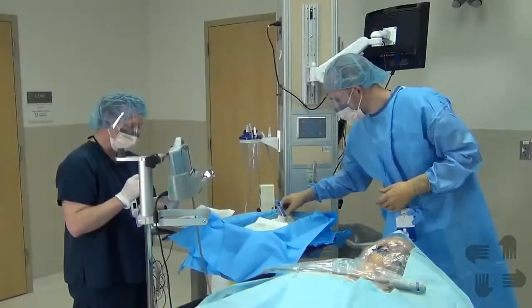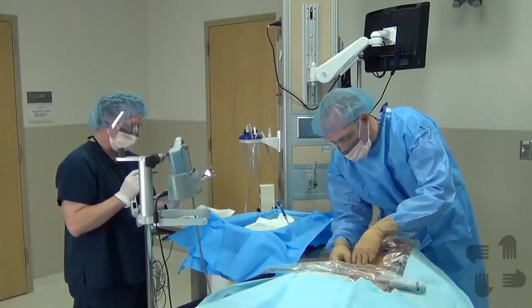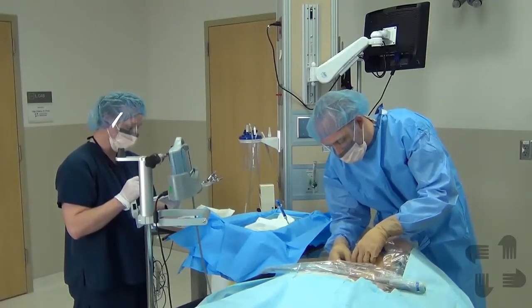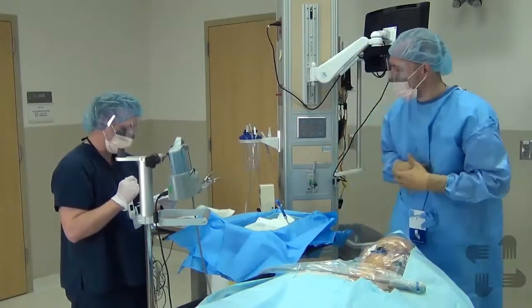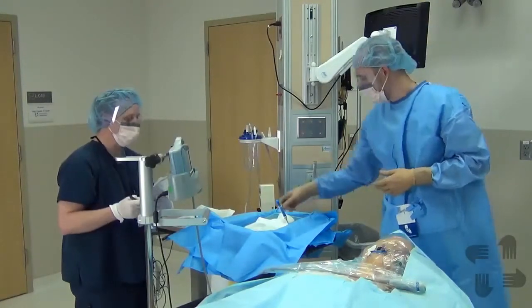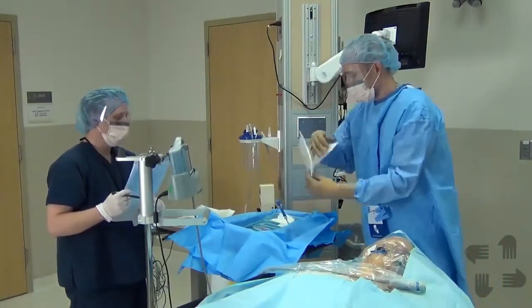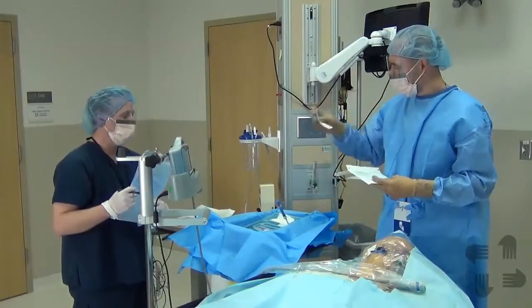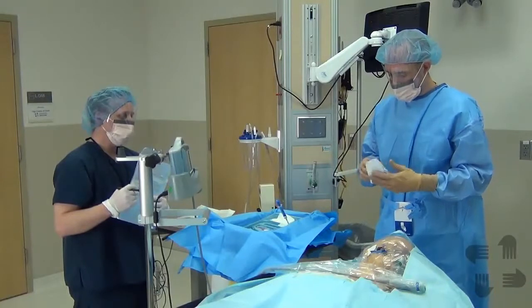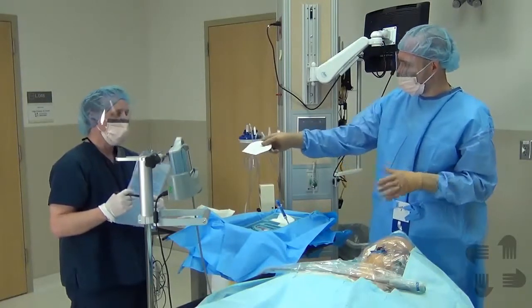So where we are in the checklist, we've flushed the ports, we put the caps on correctly, the catheter is sutured in place. Now all we have left is just the dressing. Great, okay. These things always confuse me a little bit, and I feel a little more comfortable if you put it on, because you're going to be the one using the line day to day. So here, I'll just hand this to you, and you can put this on.